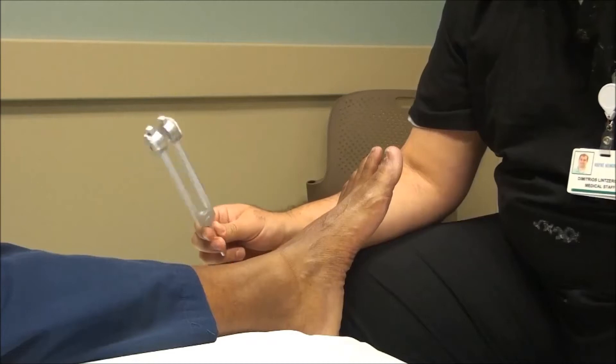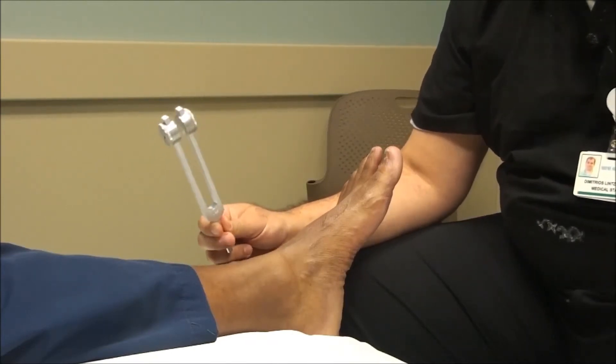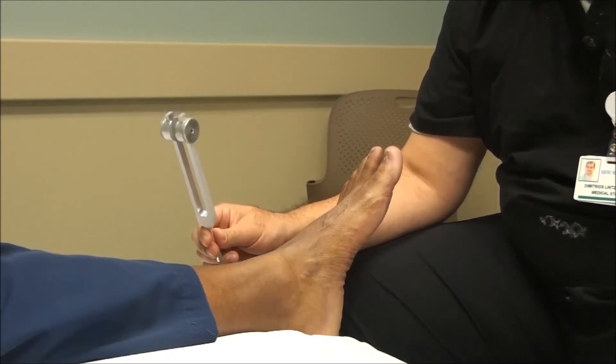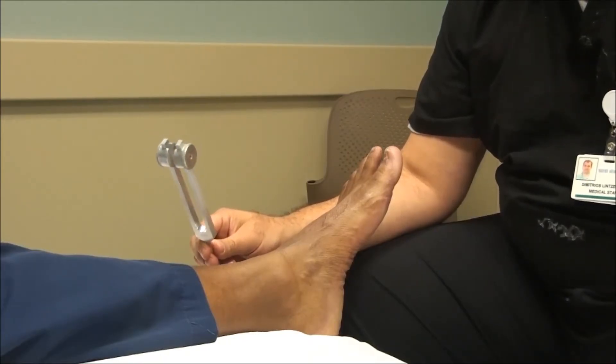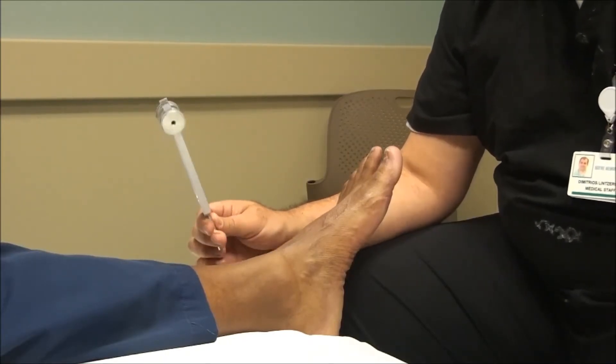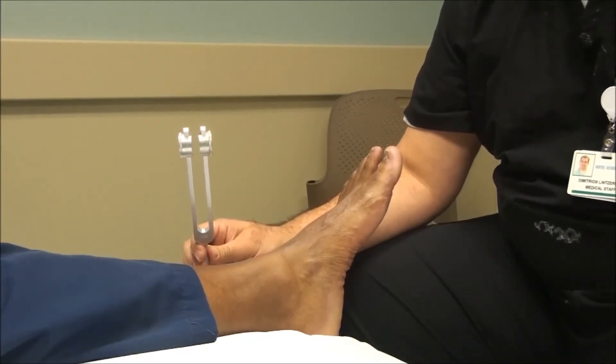It's a very simple test. This tuning fork typically costs about $3 or $4. The test is very sensitive and it's actually a little bit more sensitive than a monofilament test when looking for early loss of protective sensation. Vibration sensation tends to be one of the first sensations that's lost, so this is the ideal test for picking up on neuropathy that sometimes is missed by monofilament testing.